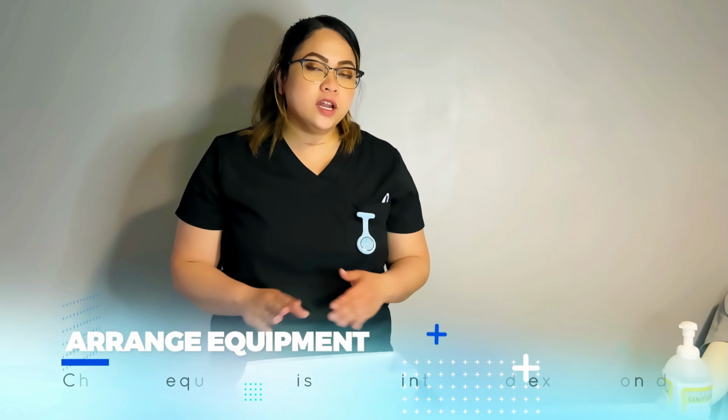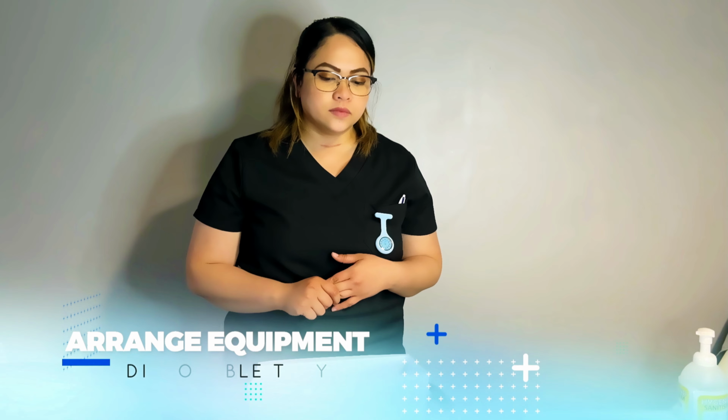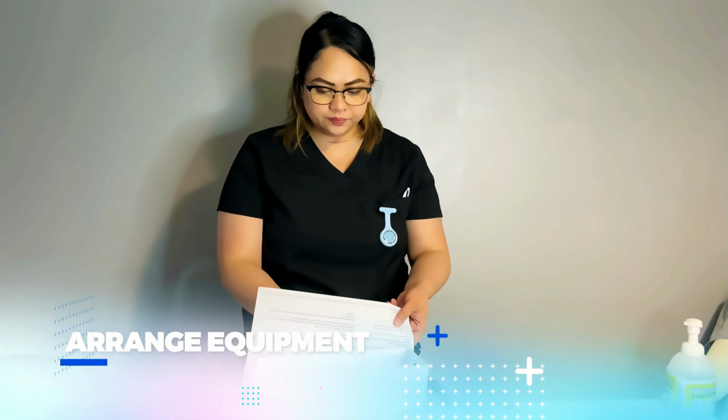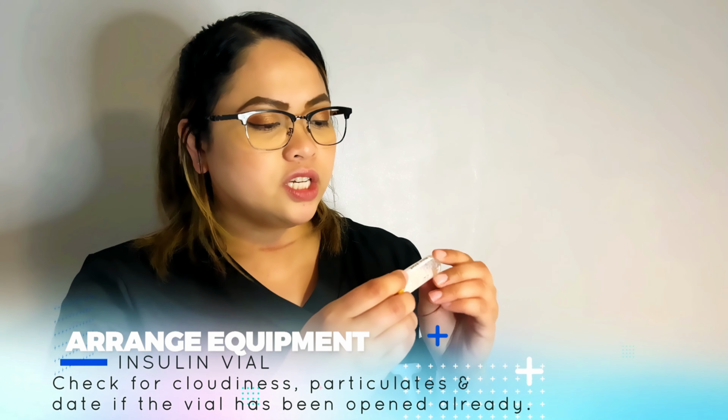Miss Examiner, are we going to use a disposable tray? Yes, that one is disposable and you can use it. Okay, so I get here my disposable tray. The next one I'm gonna get is the insulin itself. So I've got here the insulin Levemir. This is the solution for injection.